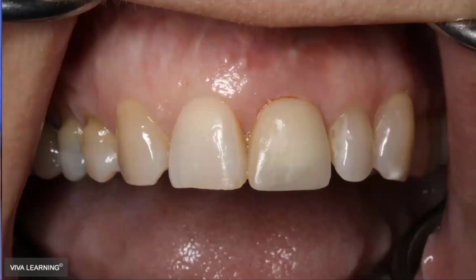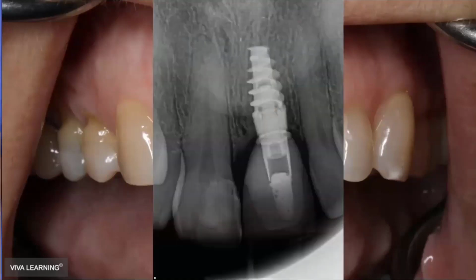We got pretty lucky. We got very, very close in shade on the first attempt on her. And again, this is a same day uncovery, anesthesia free, custom abutment we made on our CEREC from a scan that we took 4 months prior at the time of surgery, and then the EMAX crown that cements over the top. So that is one pilot laser example that we'll go over.